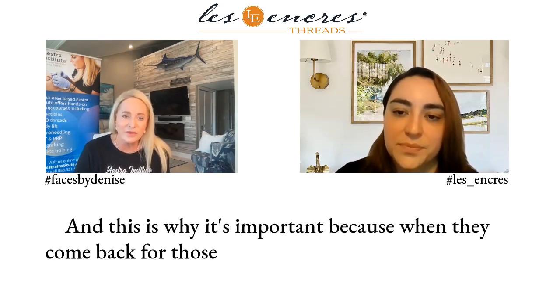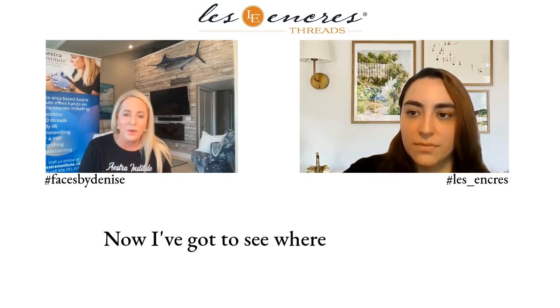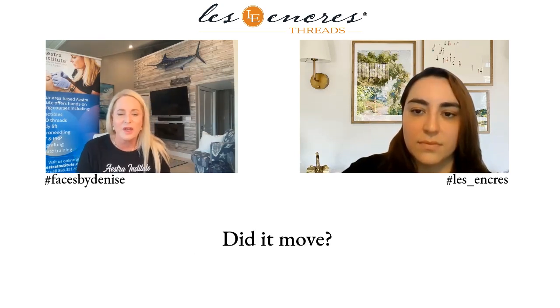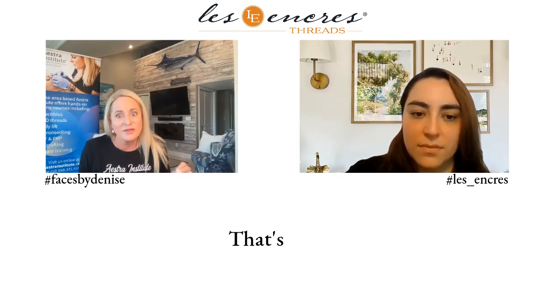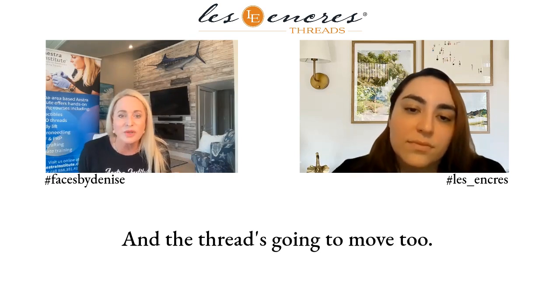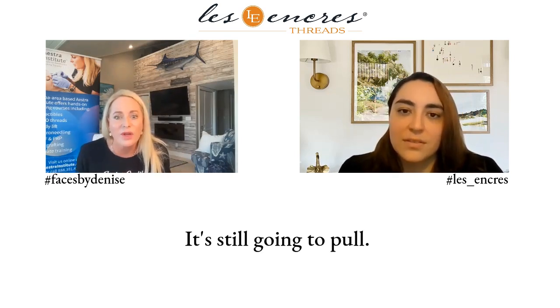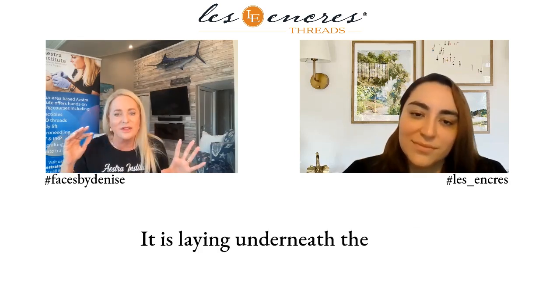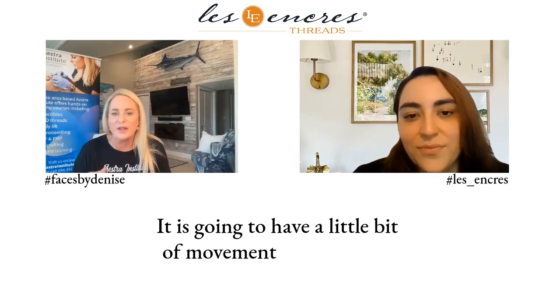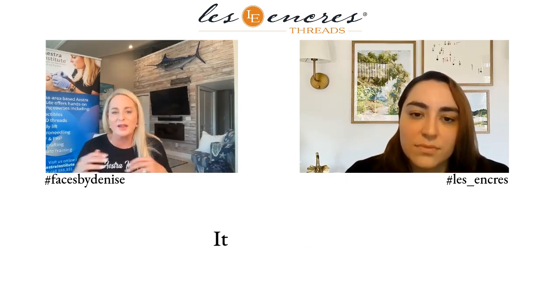Because when they come back for those side effects, what do I have to do? Now I've got to see where that thread is. Did it move? And people get crazy about, I'm going to move my face. You know what? That's fine. And the thread's going to move too. Who cares? It's still going to build collagen. It's still going to pull. You didn't ruin the thread by yawning. It is laying underneath the skin. It is going to have a little bit of movement and it's okay. It's not detrimental. It didn't break. It didn't move.